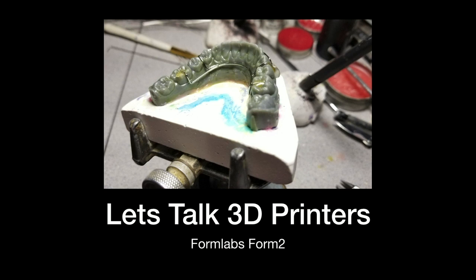So when I pour up a model, I still do the classic stuff. I always mismeasure. I always get more than I want. And instead of throwing it in the trash, I make a big plaster patty, and I put it on a model trimmer, and I trim the base. And then I zap it, and I get the Zap It from Hendon plug. You see my little pink Zap It. And I zap it to the base, and that fits my model holder. It makes it easier to bend.